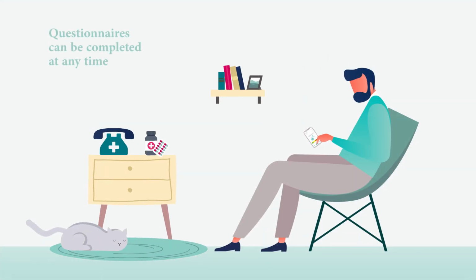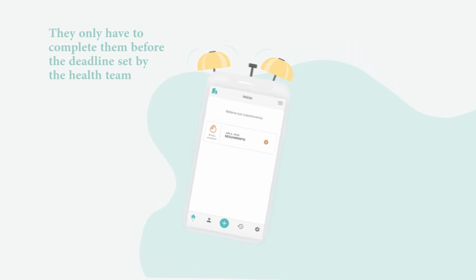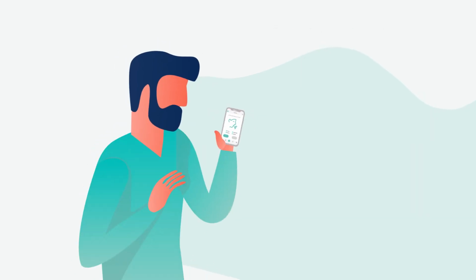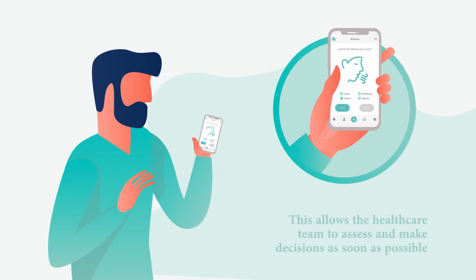These questionnaires are automatically generated according to the patient's situation, who can fill out and send each one in the manner they prefer, all at once or in parts. What they do have to be aware of is reporting it to the medical team before the deadline. Finally, it's important to know that, apart from the questionnaires, the patient can report symptoms at any time, which allows the medical team in charge of their follow-up to assess the situation in an updated way and make decisions as soon as possible in case of need.